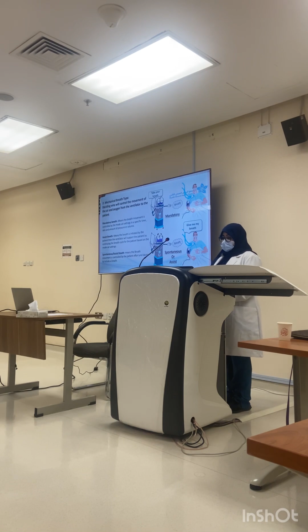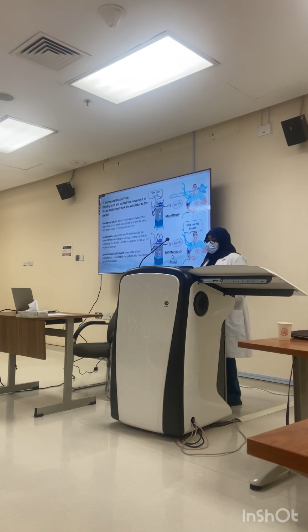Spontaneous breath is controlled by the patient. So the patient will decide when to start, when to end, how much volume, how much pressure, how fast the breath is going to take, how slow. It's all on the patient.